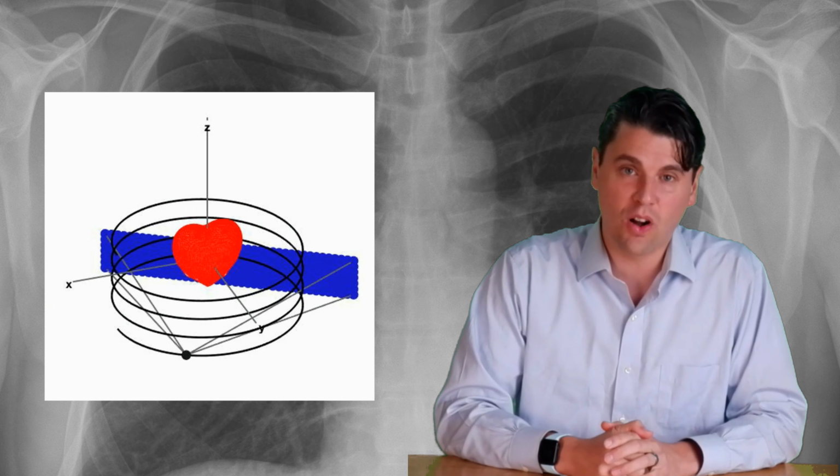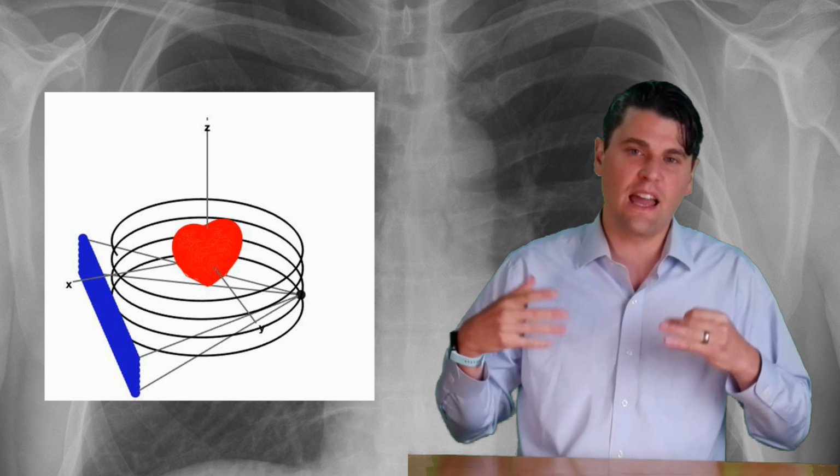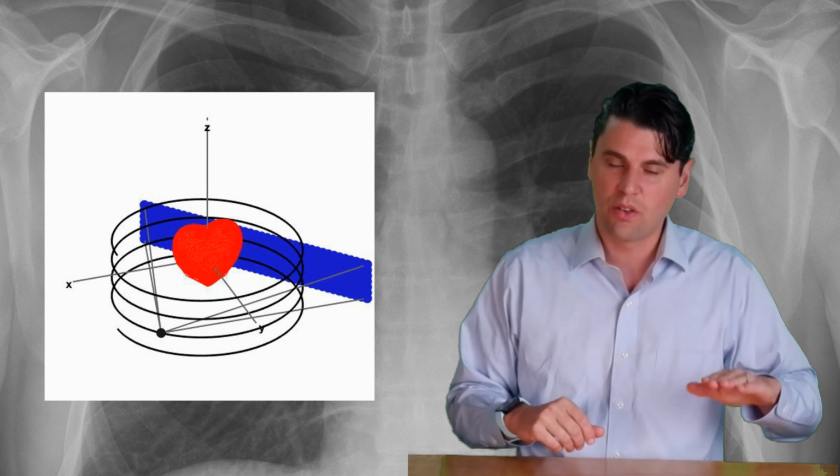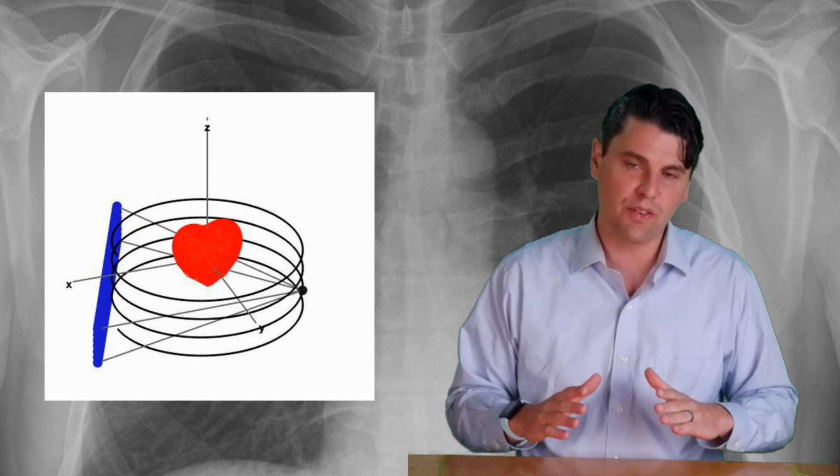In traditional helical cardiac scanning, it's actually a pitch around 0.2 or less which is used. So it's a very low pitch helical scan.